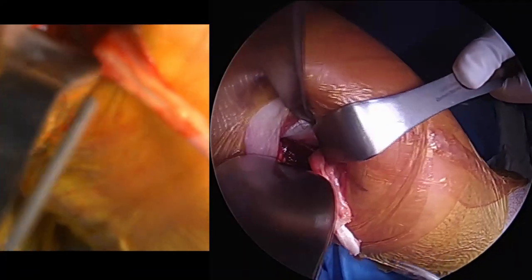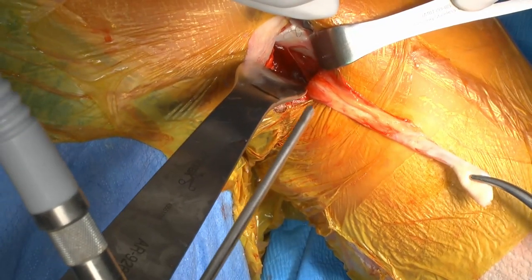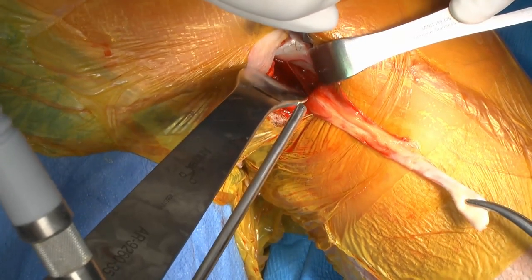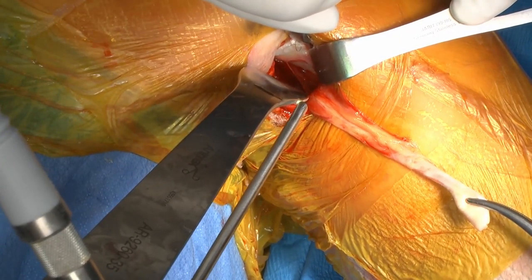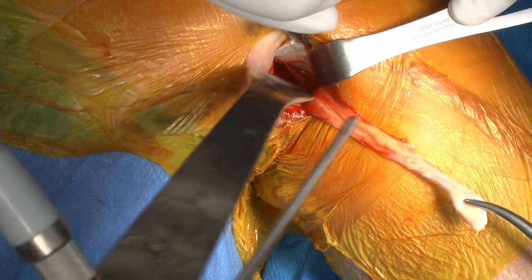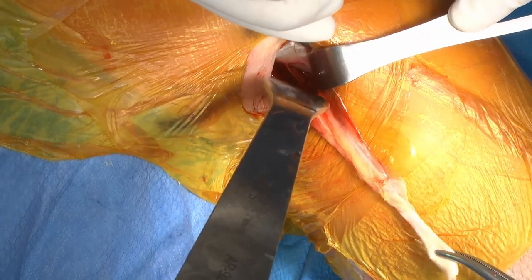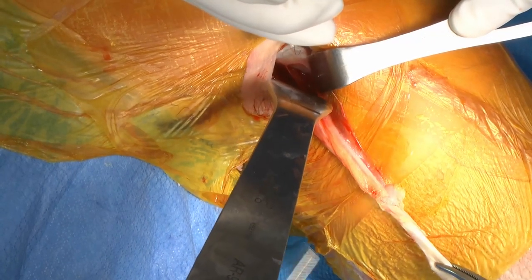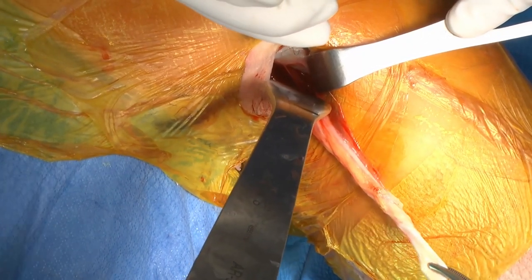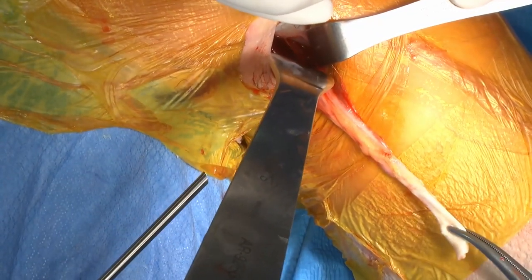This is important to recognize how far down the biceps, that's all synovitis, all the way down to the upper part of the muscle, which is where the pec comes into play. So again, this is one of the reasons we often prefer the subpectoral biceps tenodesis instead of the higher up, because of all this extra synovitis that's seen and evident on the biceps tendon. Yeah, all the way down to here.